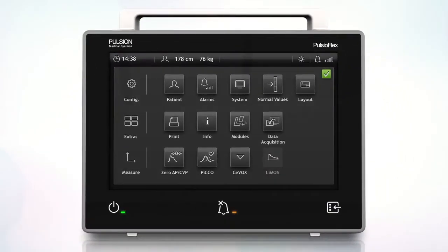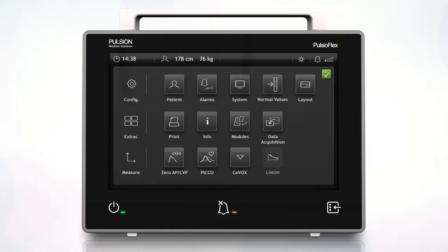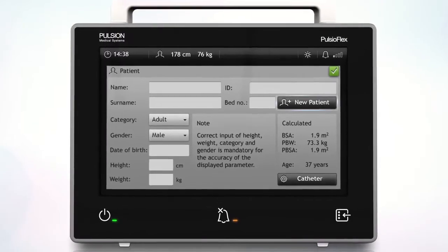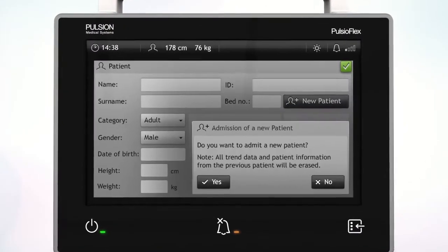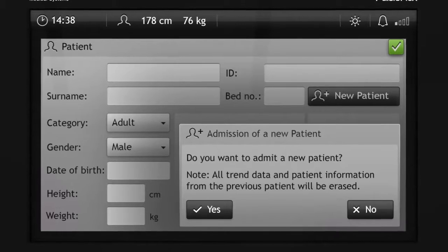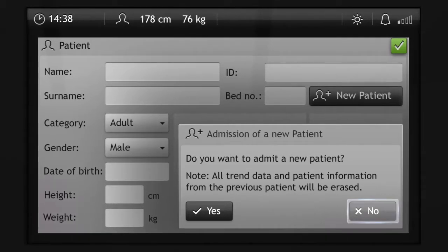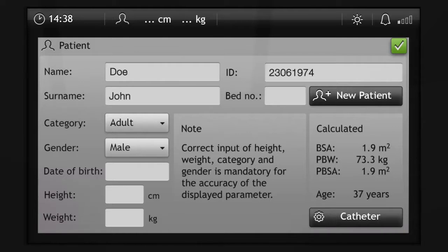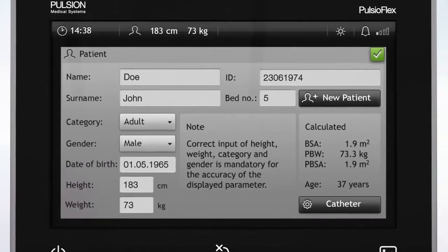To enter the patient profile, tap on the patient button in the main menu. First, you have to admit a new patient. Press yes to delete the saved data for a new patient, or no to keep the current patient profile. Then type in the patient's data and characteristics. When you're finished, close the window by tapping the check mark.